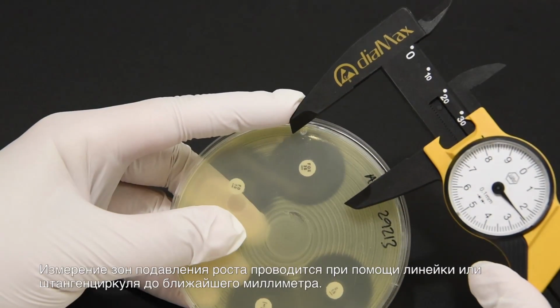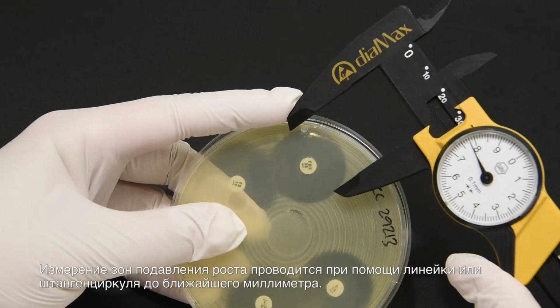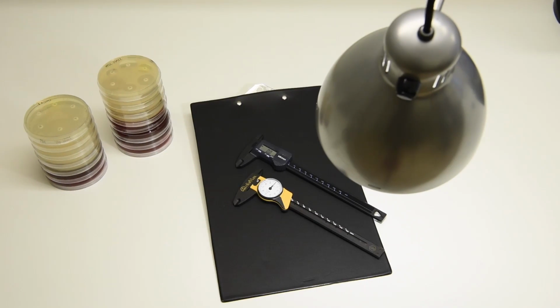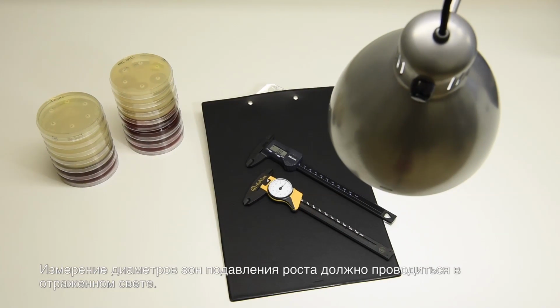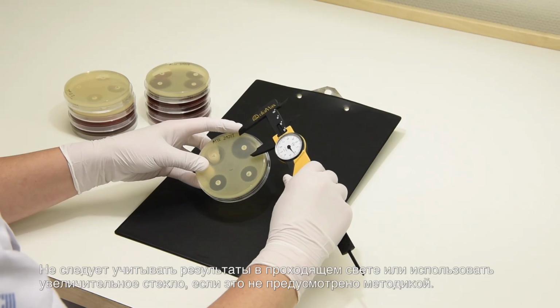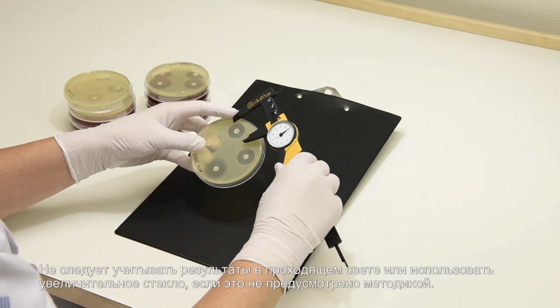Measure inhibition zone diameters to the nearest millimetre with a ruler or a caliper. If an automated zone reader is used, it must be calibrated to manual reading. When reading zone diameters, plates should be illuminated with reflected light. Do not use transmitted light or a magnifying glass unless so stated in the manual.